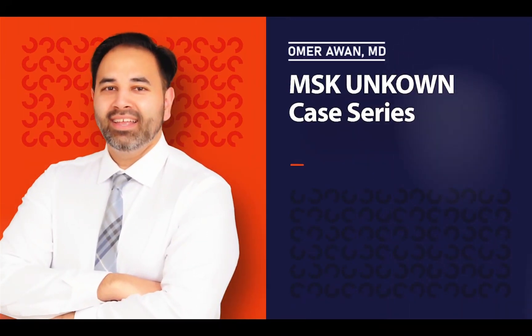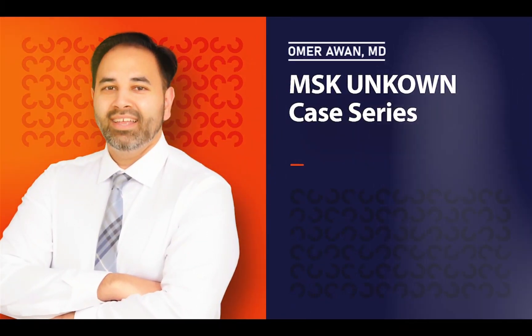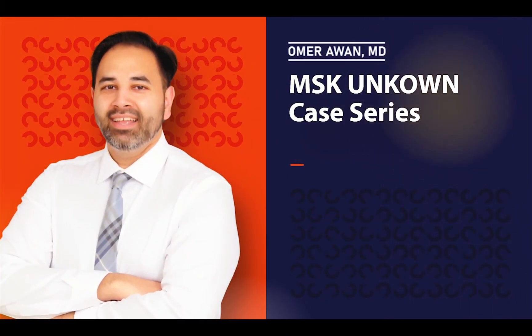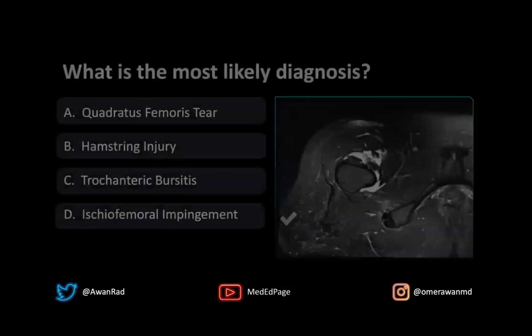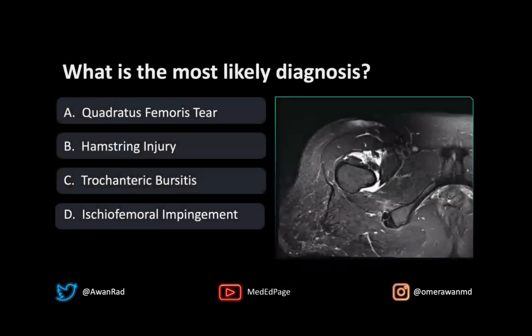Hello everyone, and welcome to MSK Unknown Case Series, Case 91. This is an axial T2 facet image through the hip, showing an important finding. The high-yield question is: what's the most likely diagnosis?